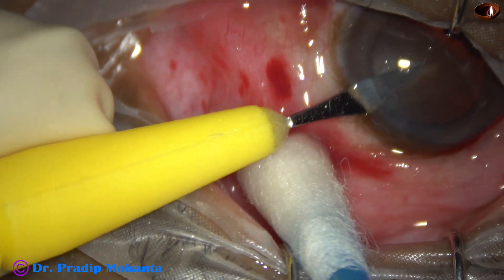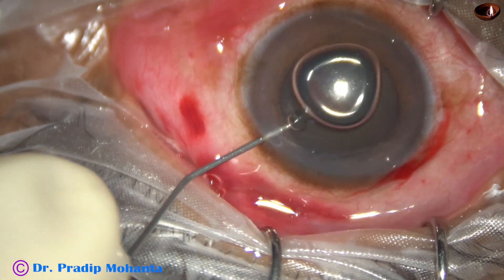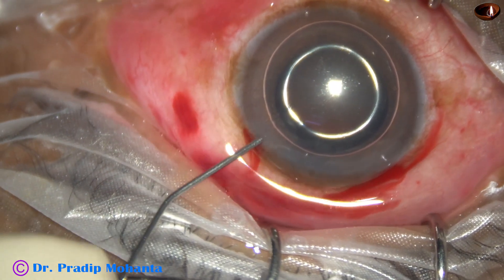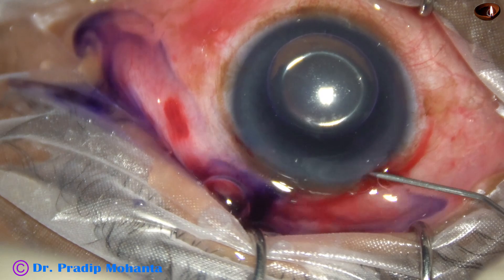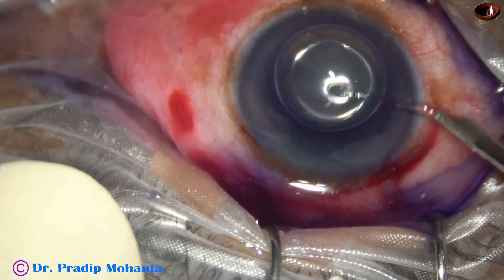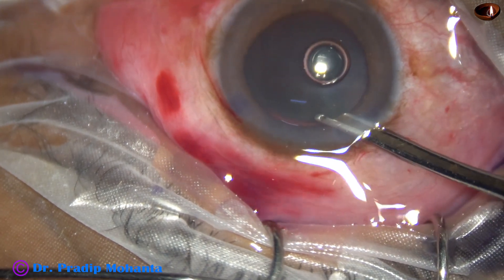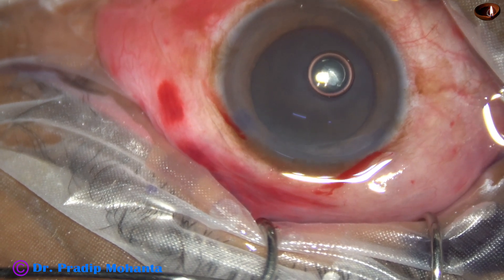The pupil is mid-dilated and I hope the surgery can be completed without using any pupil expansion device. An air bubble is injected to fill up the anterior chamber, then trypan blue dye is applied over the anterior capsule. The trypan blue dye should touch all parts of the anterior capsule. The dye is washed out, giving uniform anterior chamber with uniform density of dye all around.